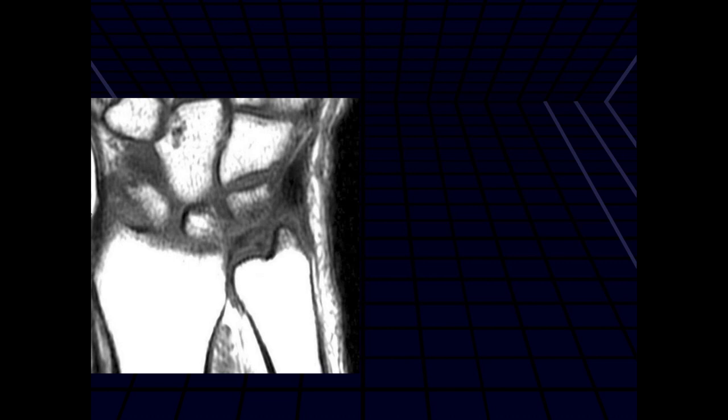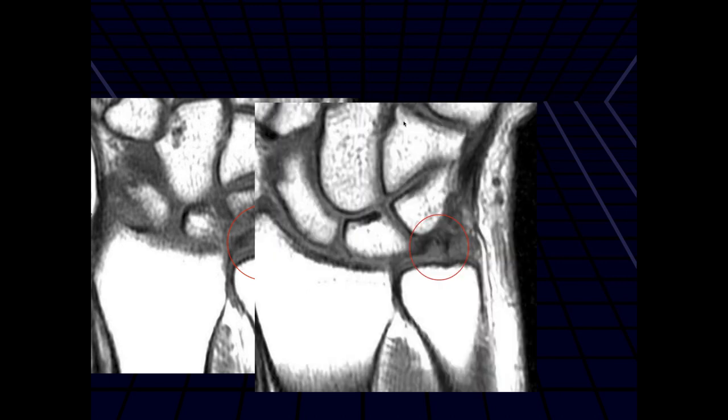Let's carry on from where we left off last time. Jennifer, why don't you take this case? Here we just have a single coronal T1 image. It looks like there's some increased signal along the peripheral aspect of the TFC disc, which is concerning for a peripheral tear.